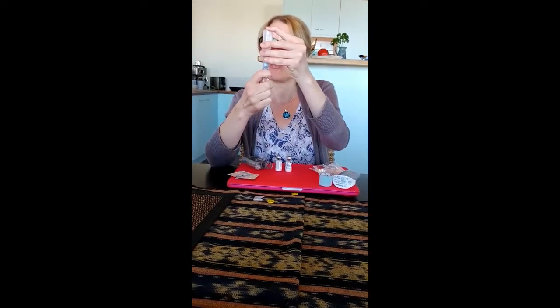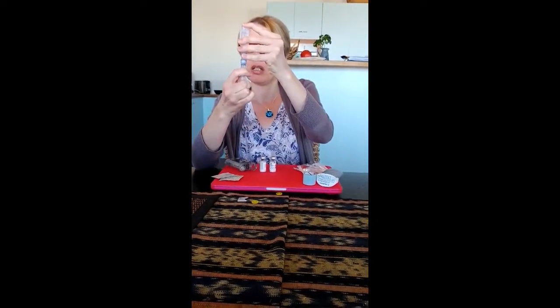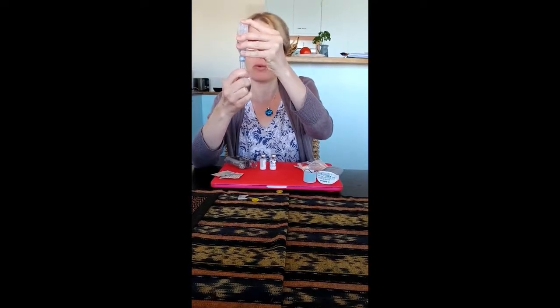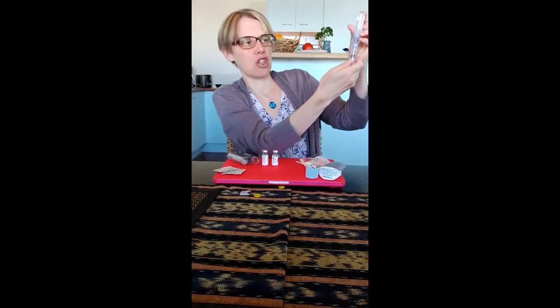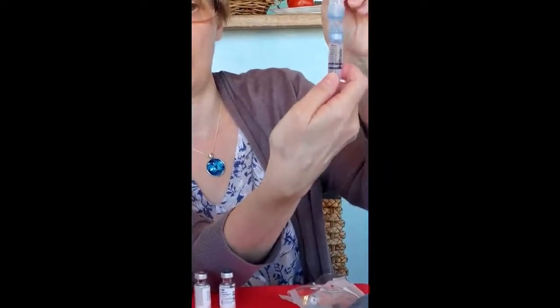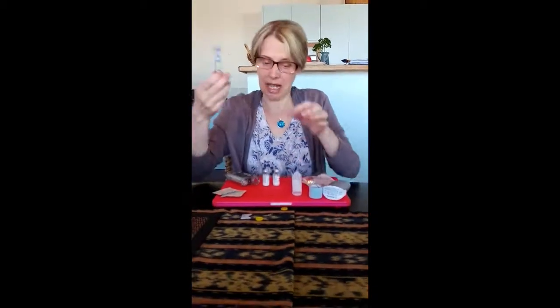I'm going to draw up two ml of water to fill two Solu-Cortef vials. I draw it up until I get two ml of water — no hypodermic syringe needles or anything involved. You can see it's just sitting on the two ml line.